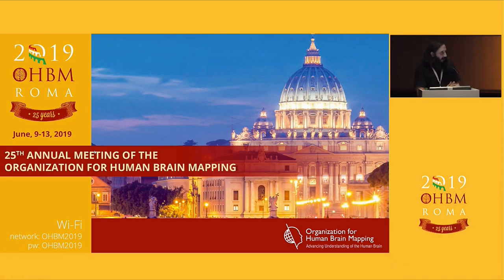It's a long answer. I'll try to be quick. First of all, those are multi-echo, so those are not MP2RAGE, right? I think we just did two echoes, so not really quantitative. I mean, you could try to fit T2* from two echoes, but I wouldn't advise it. So these are really qualitative images, just T1-weighted.